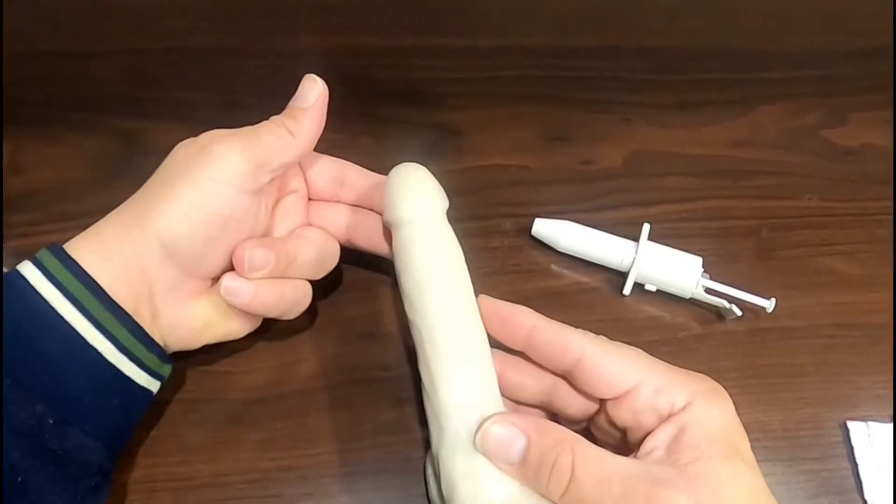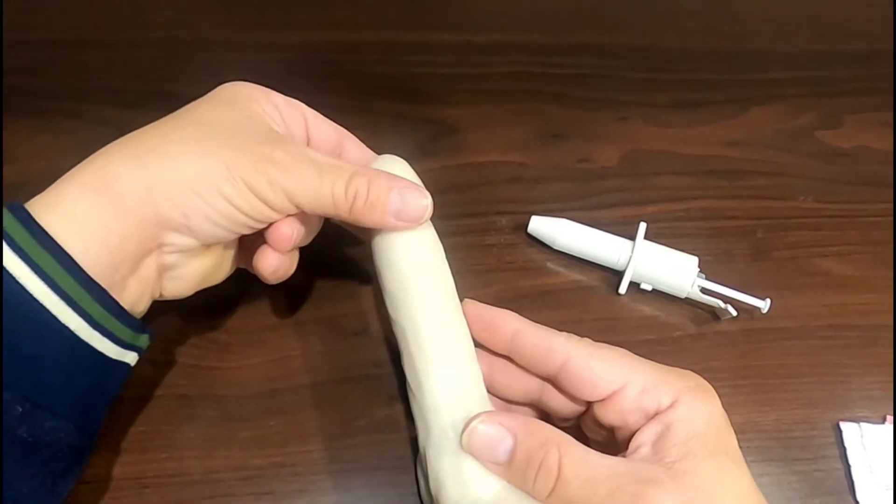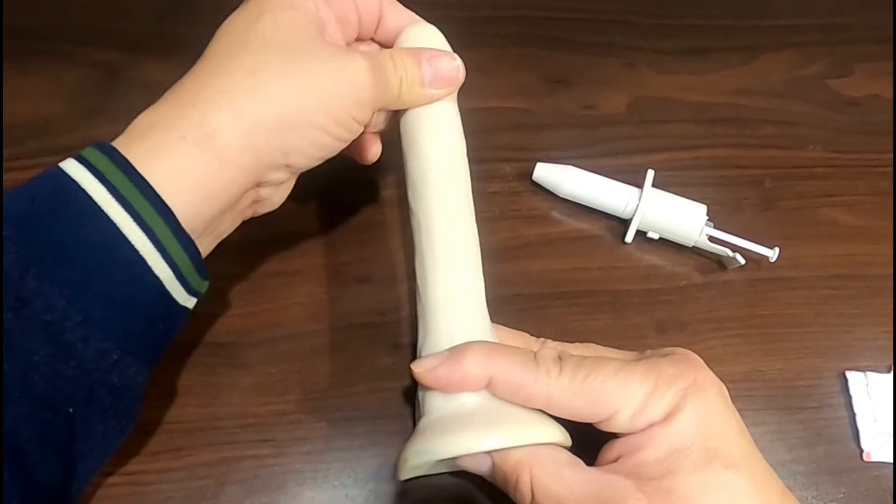If you're right-handed, use your left hand to place two fingers under the head of the penis and your thumb directly opposite on top of the head. Avoid grabbing the foreskin as it may be slippery. Stretch the penis out fully and keep it stretched for the entire application process.